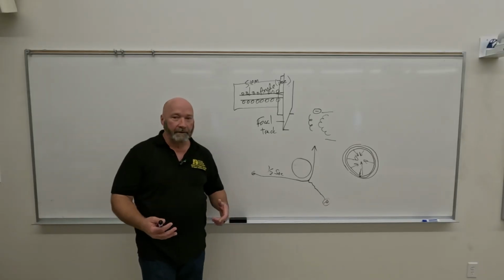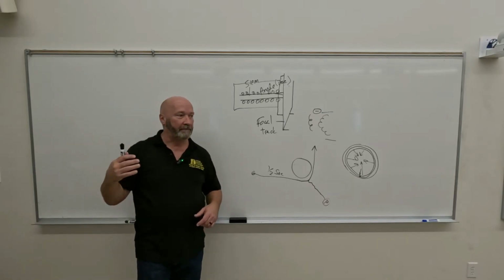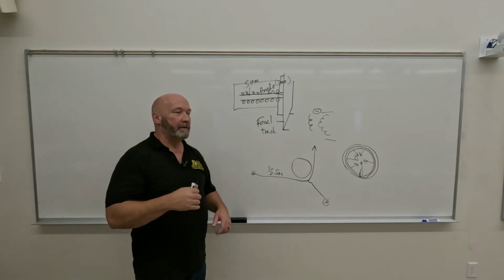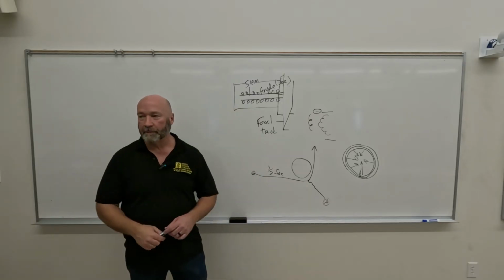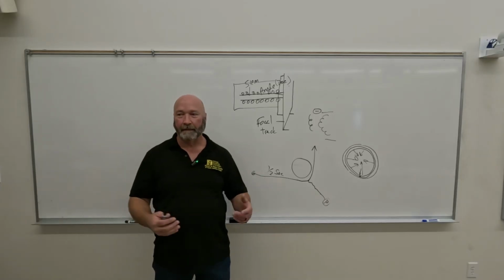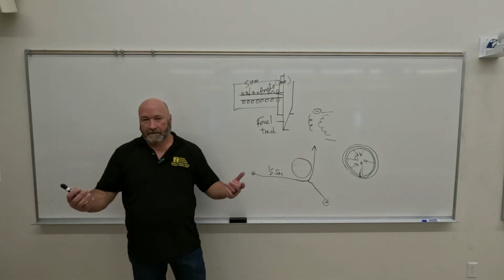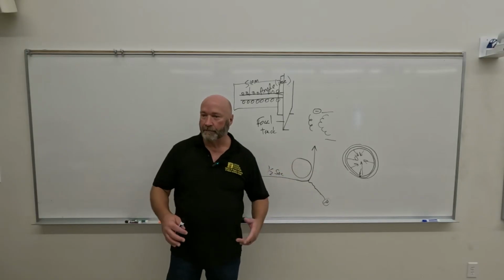So we use molybdenum because we don't need that 69.5 KVP characteristic X-ray photon. We don't even need those high energy bremsstrahlung photons. We're not going to be shooting with more than 25 at the absolute top, maybe, probably, I don't know, I've never done mammo, but maybe 40 KVP, absolute top. So it's going to be low KVP. We don't need tungsten. We're going to use molybdenum for those.